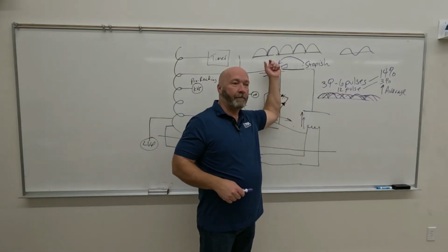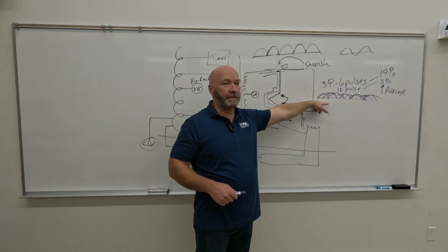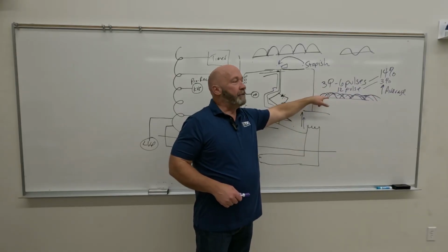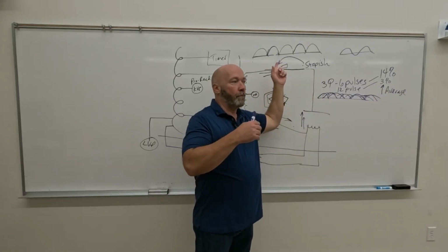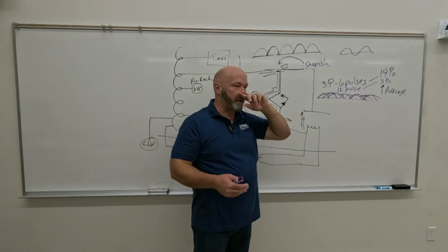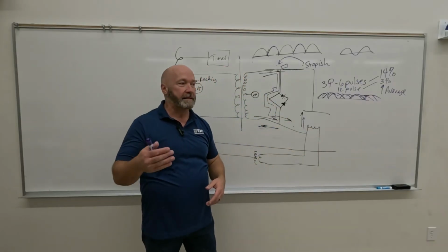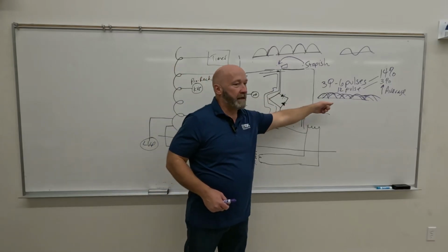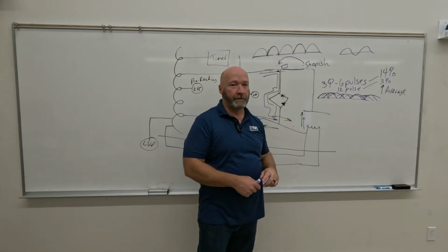Okay, what's your output on a single-phase machine compared to a 3-phase machine? It's half. It's half, right? So if you use that same technique in the single-phase room, what is your index number going to look like? It looks like you underexpose the patient by exactly half. So if you take that technique and apply it to a single-phase room, what are you going to have to do?